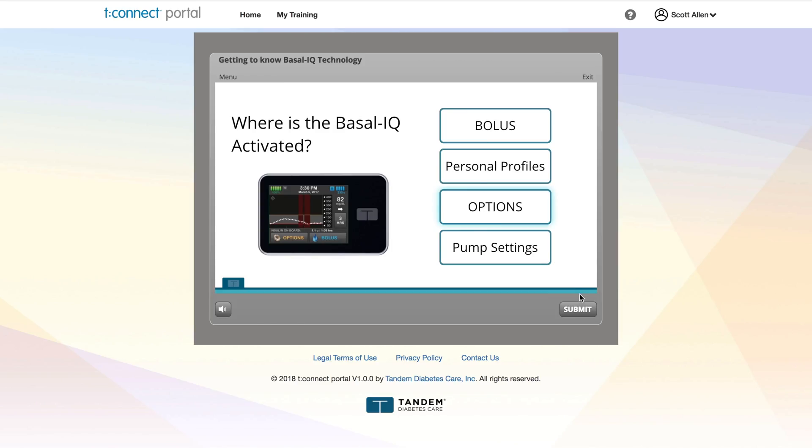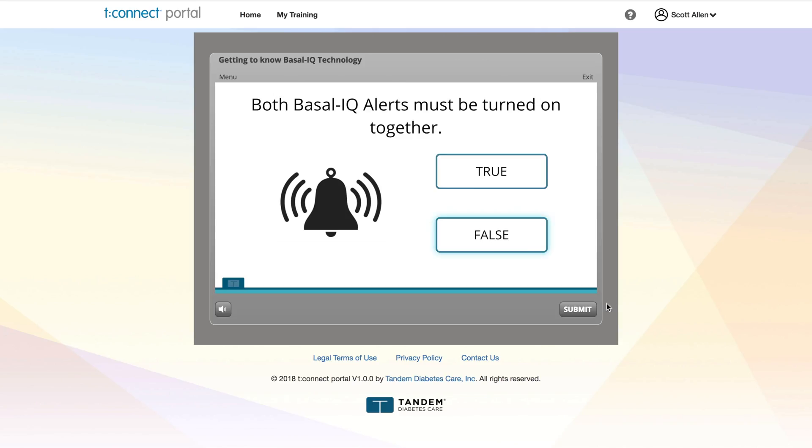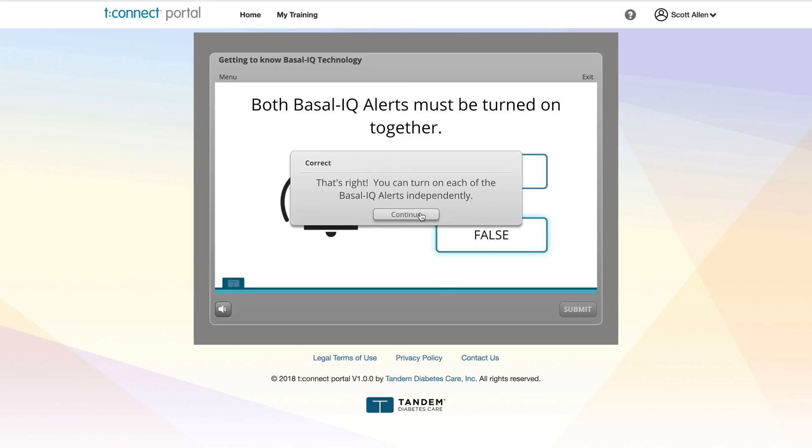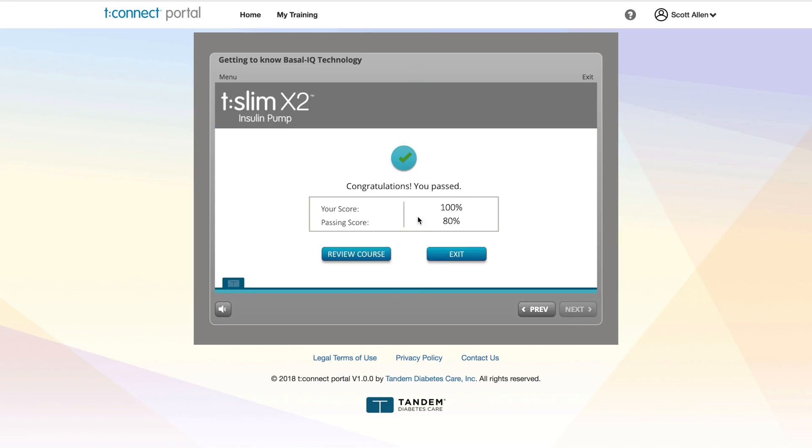If you're going to do this update, maybe download Google Chrome first in case you don't have it. Let's go through a few questions on the material. What is the predicted threshold used by the Basal IQ technology to stop insulin delivery? That's right. You have successfully passed this course.